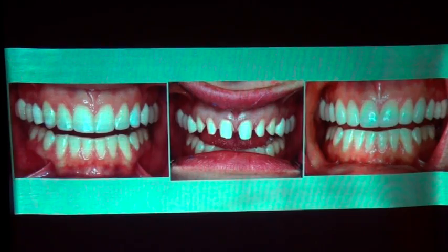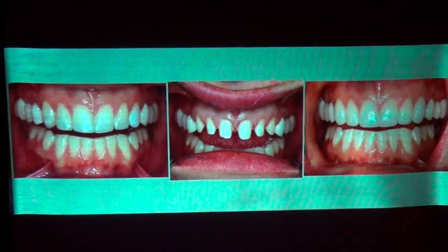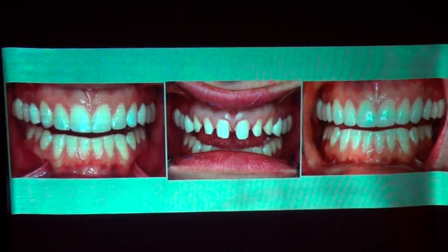We basically just took off, broke contacts, because we had to open up verticals. We had to do the lingual surfaces as well. We couldn't just do veneers. And that's what we provided her.